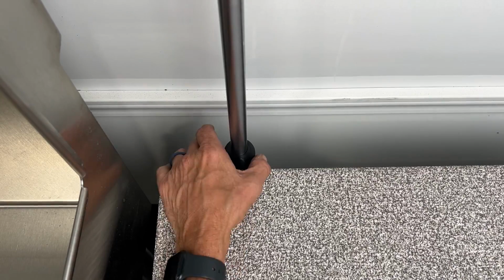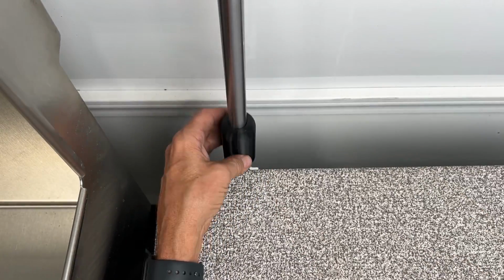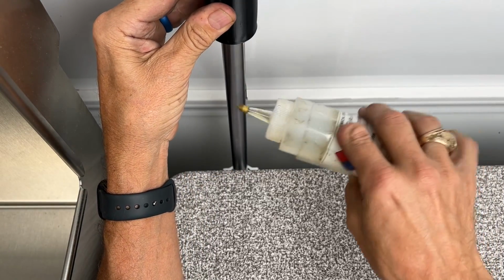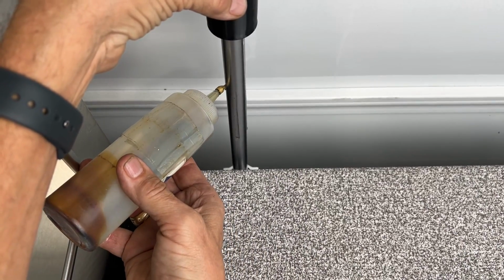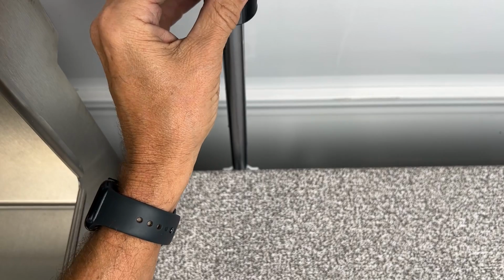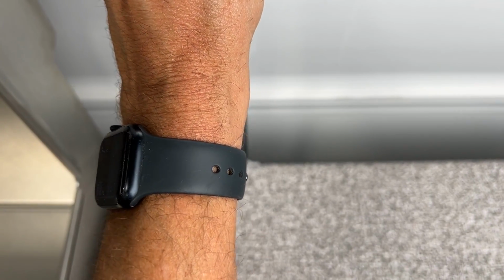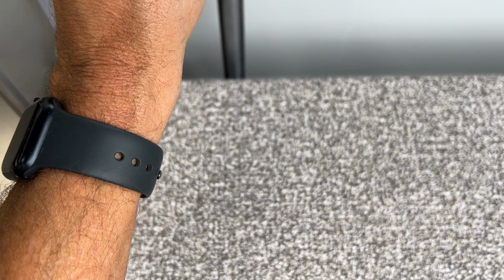Lower the table to level number 1, then raise up the spacer, and sometimes the spacers look a little different, but lift up the spacer and hold it. Place some blade oil, about 2 drops on each side of the rail, and don't forget the back side. The oil will drip and slide down the rail. Keep holding the spacer. Raise the table to number 3 level, so it will basically absorb the oil into the bearing area as it's going up.